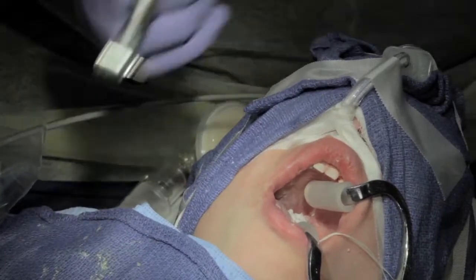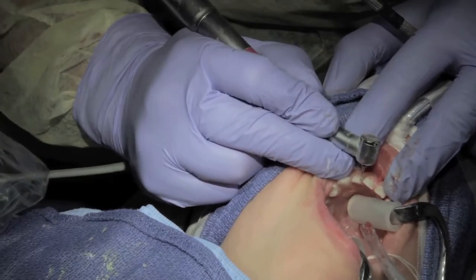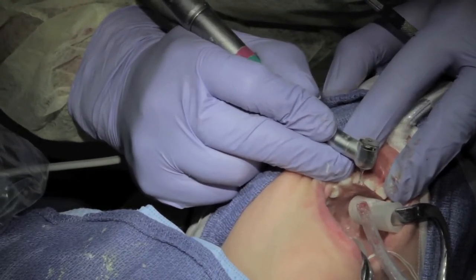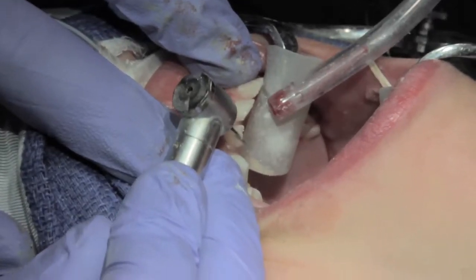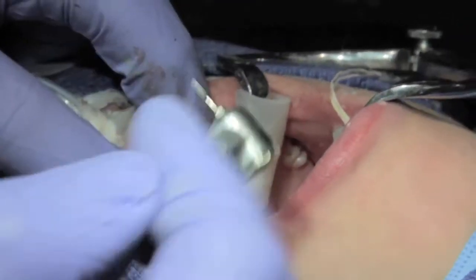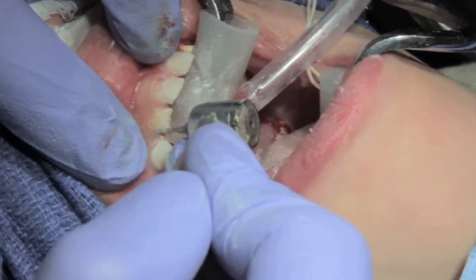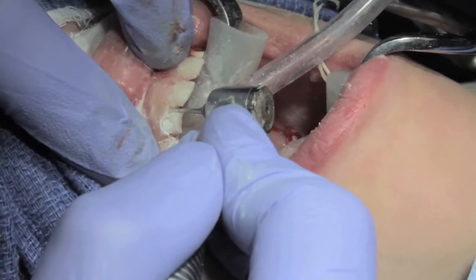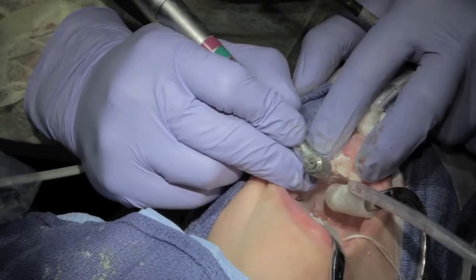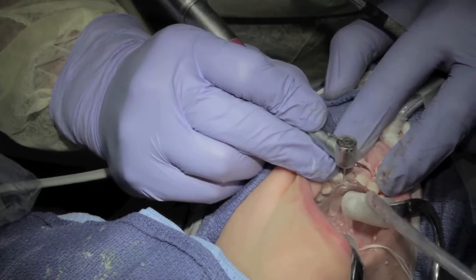Not too deep — same thing. Occlusal reduction and proximal reduction. You can see there's an old composite filling on here. Apply the double-wing rule and round off any sharp edges.